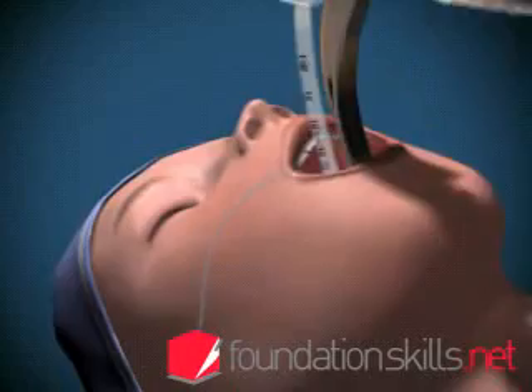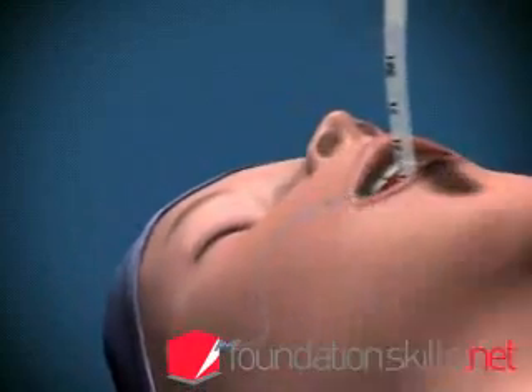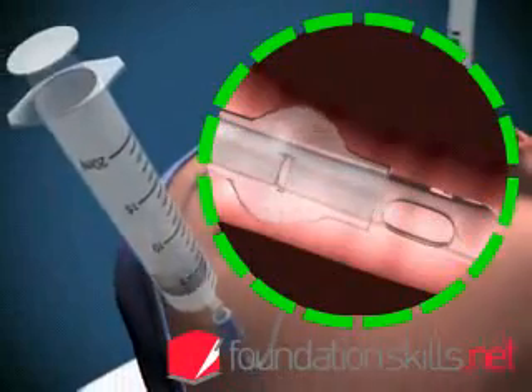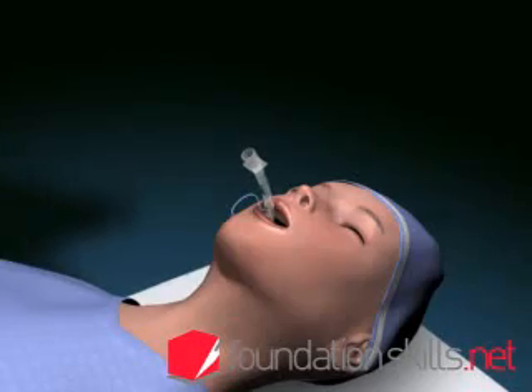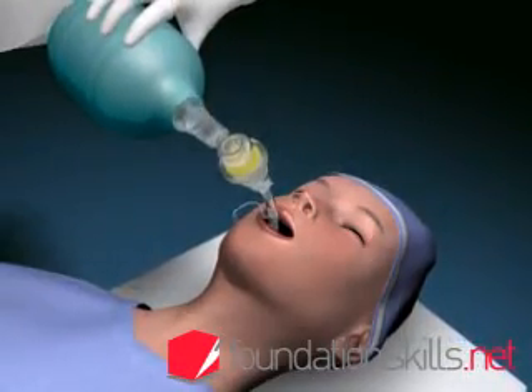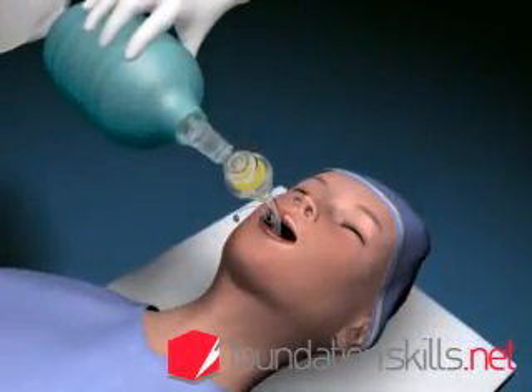Remove the laryngoscope and inflate the cuff with approximately 15 mls of air to prevent air leaking during ventilation. Attach the tube to the bag and valve apparatus and ventilate the patient with the oxygen flow on 12 to 15 liters per minute.